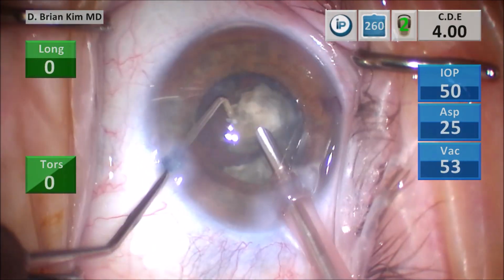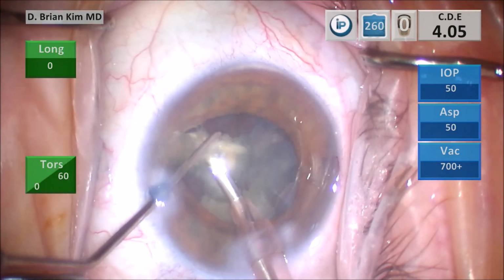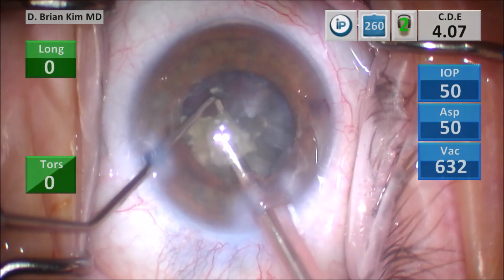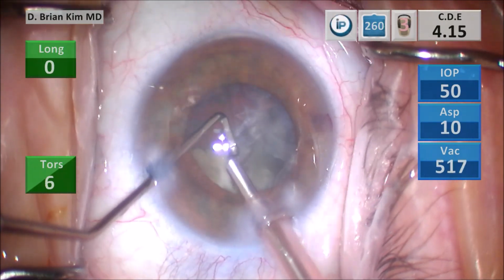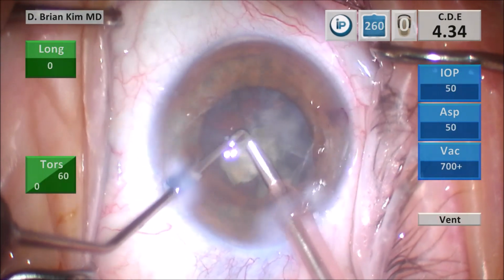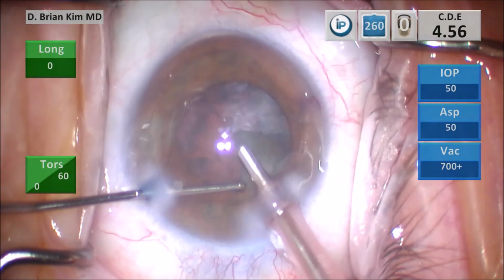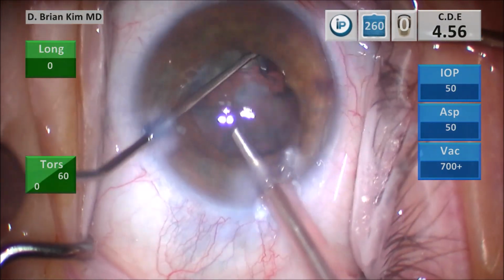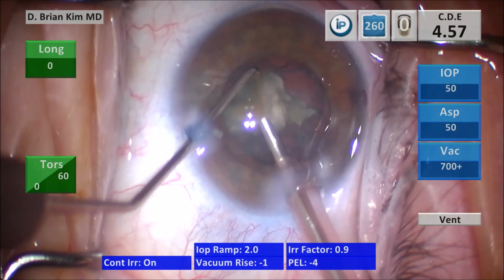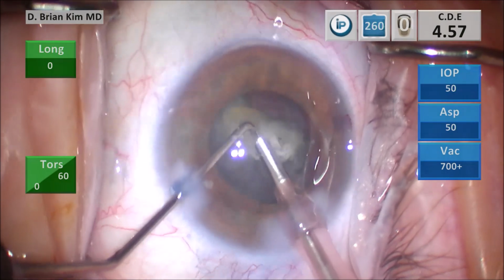In my opinion, this is just a very safe and methodical way to disassemble the lens, because sometimes you have to get close to the posterior capsule. And with this technique, you can get the instruments near the capsule, but it's not going to cause a problem because you're not going to accidentally aspirate the capsule or use ultrasonic energy to break the capsule. You're just using your two instruments to very carefully break up the lens. And so the chances of you breaking the capsule doing these maneuvers is very, very low.